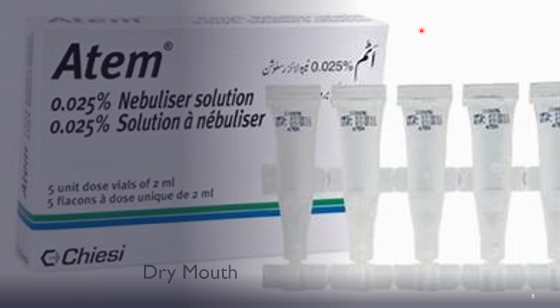So you can see in the wards there are many patients complain of dry mouth once they have the 6 hourly or 8 hourly nebulized with ipratropium bromide more than 2-3 days. So once the patient has significant complaint of dry mouth, you can either decrease the frequency of the nebulizer or decrease the dose of the nebulizer.